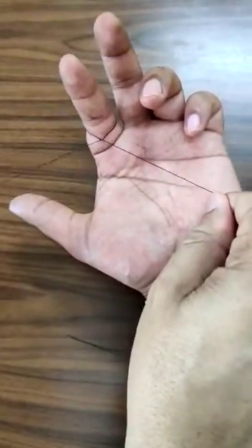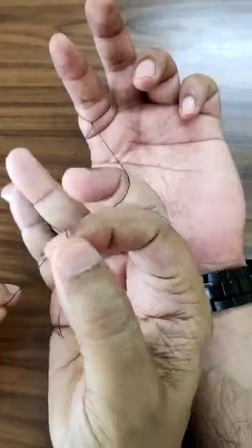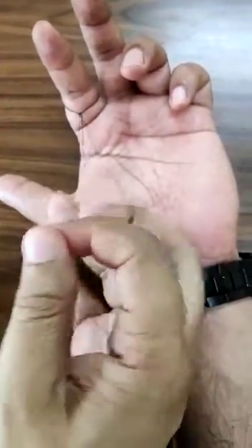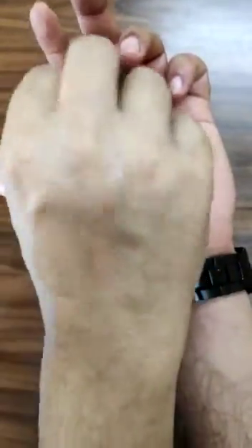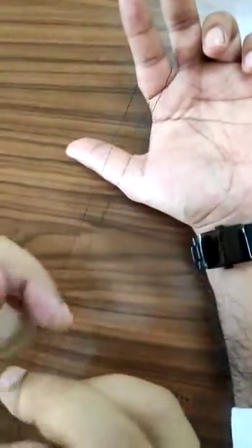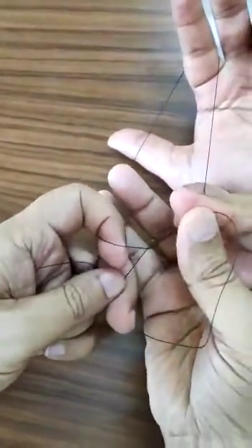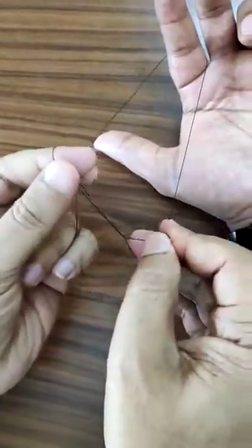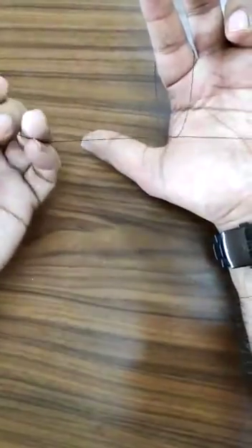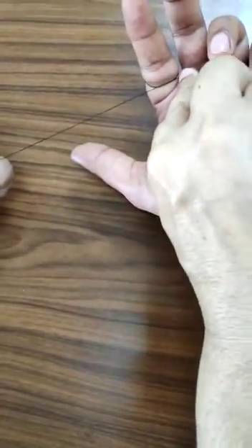If I pull it like this it is unsquared, and an unsquared on top of an unsquared is going to become completely loose. That's why every knot needs to be secure — it needs to be surgeon's and square. This is square, and this is surgeon's, and it is going to be pushed like this.